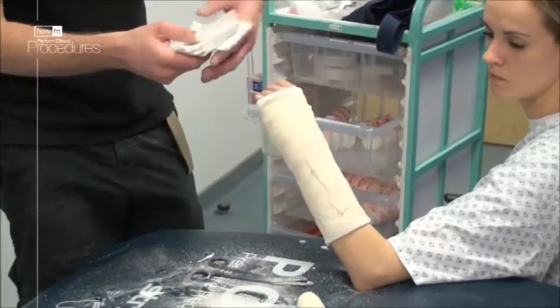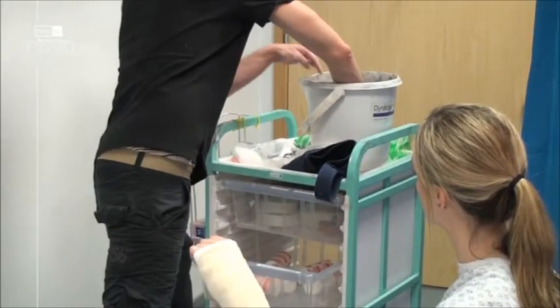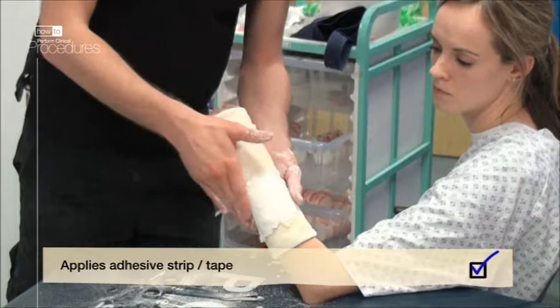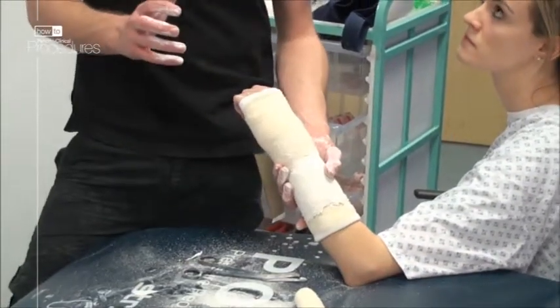Using your offcut saved earlier, submerge it in the water for around four to six seconds, then place over the edge of the crepe and smooth as shown. This will fix it in place. An alternative is to use some pink tape.